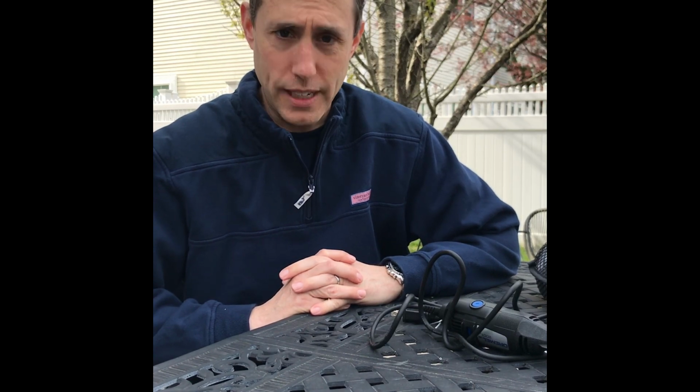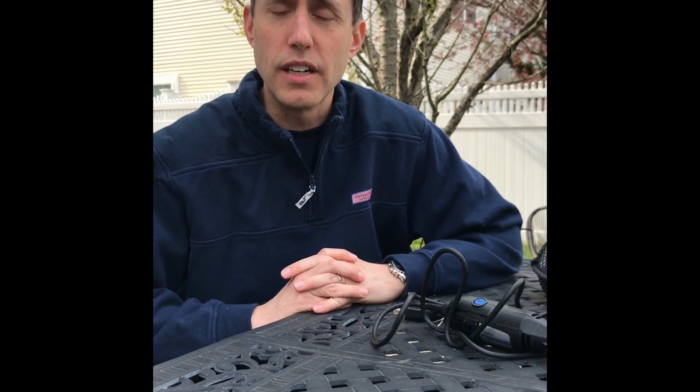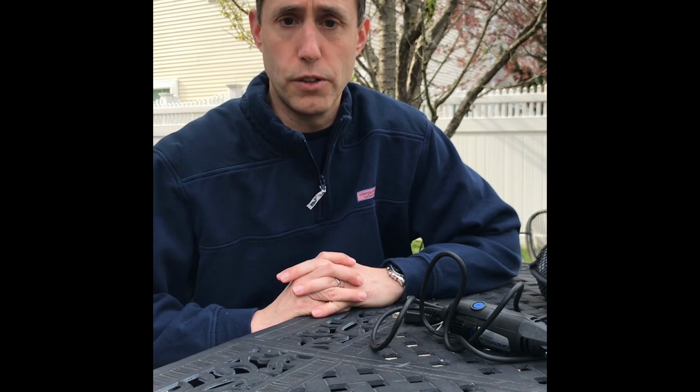I want to show you today how to make a snorkel mask with a filter that can be used for personal protective equipment. With the COVID crisis, there is a shortage of personal protective equipment, especially N95 masks. And there's always a question as to how reliable N95s are and whether or not we can improve on the effectiveness of those masks. I have a disclaimer: even though I'm a doctor, I'm not an expert in designing these masks, and these are not FDA approved and have never been formally tested in any way.